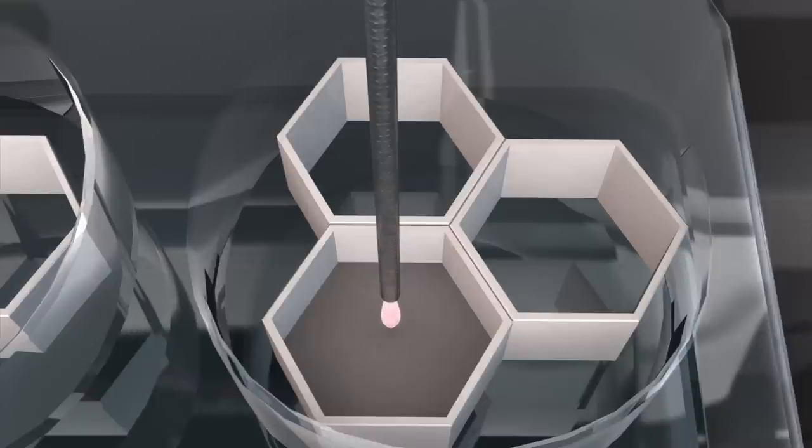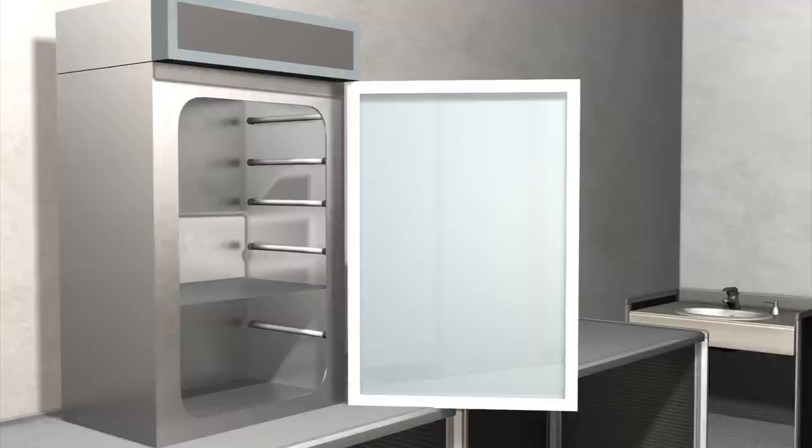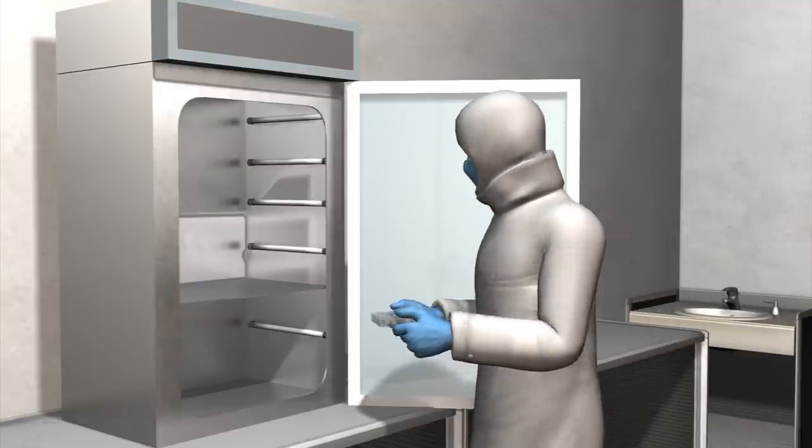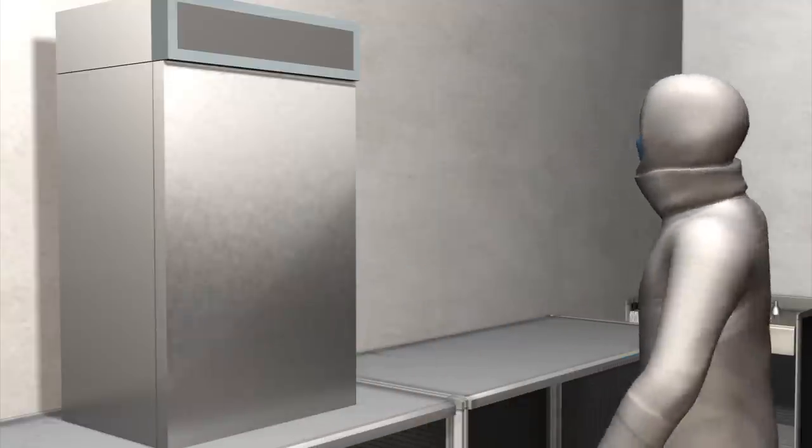Once the different cells are mixed, the well plate is placed into an incubator where they continue fusing until they eventually form the complex matrix of a liver tissue.